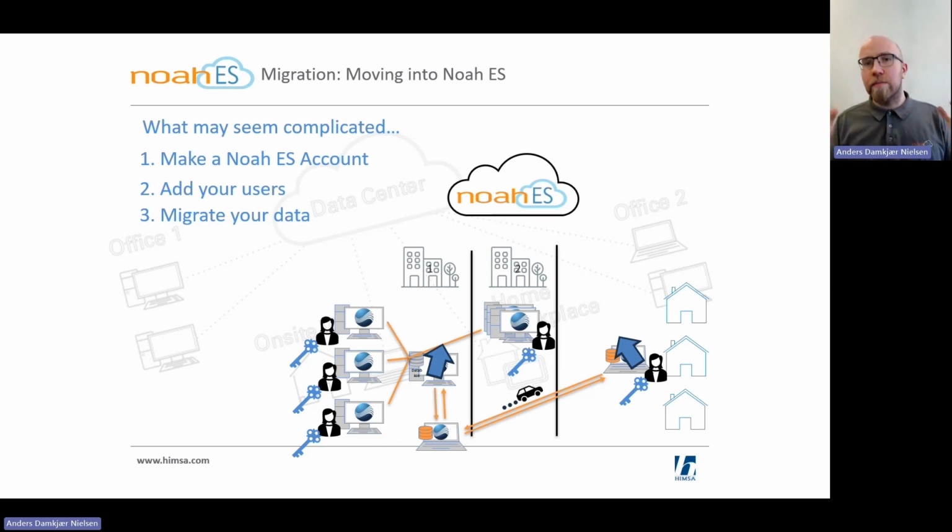So you don't lose anything, but there's only one, because we can tell quite strictly that it's the same person. There's a little hidden number inside of the patient data, basically, that specifies that this can only be this person. It's a bit technical, so I won't get into it, but you can be very sure that it won't cause you to get two of every patient or anything like that. It's very, very safe in that way.